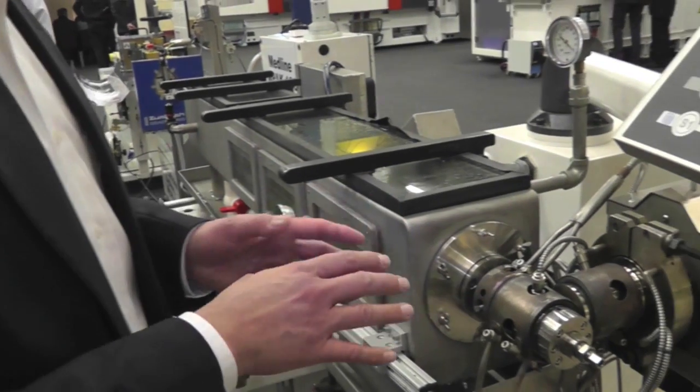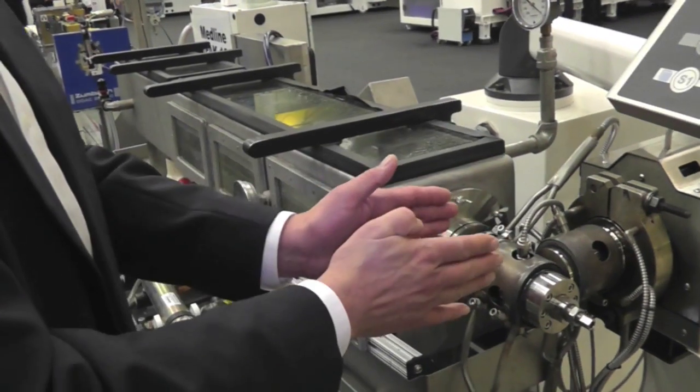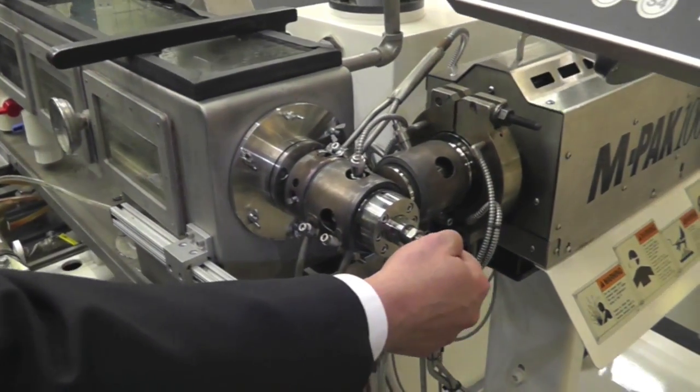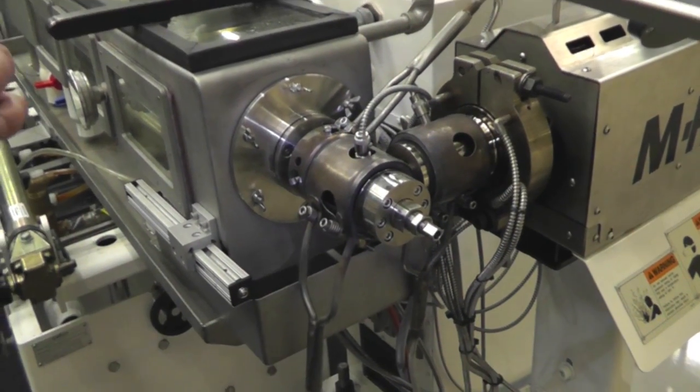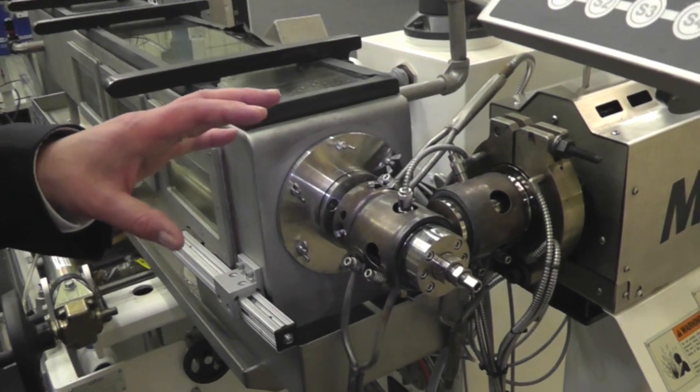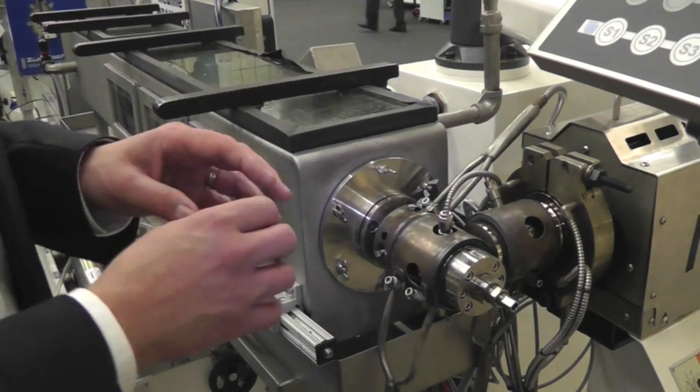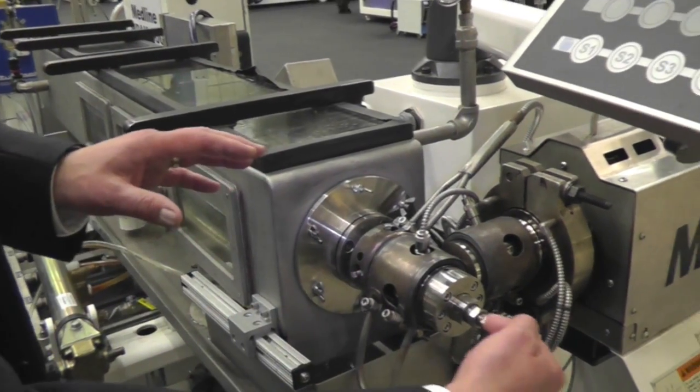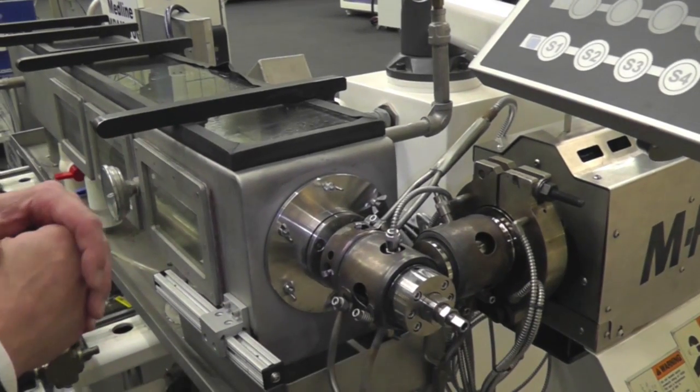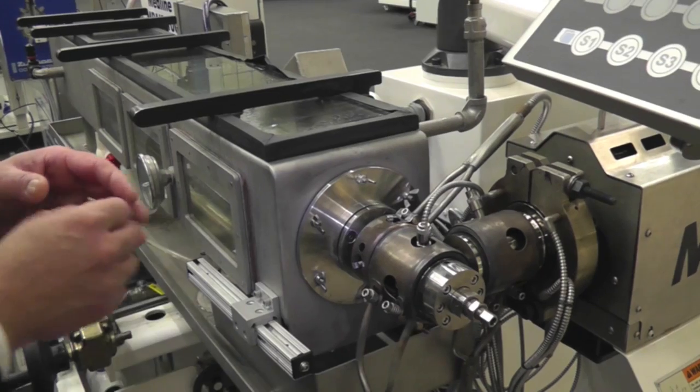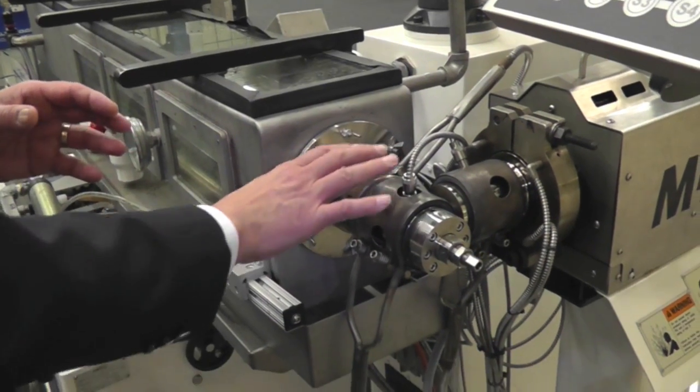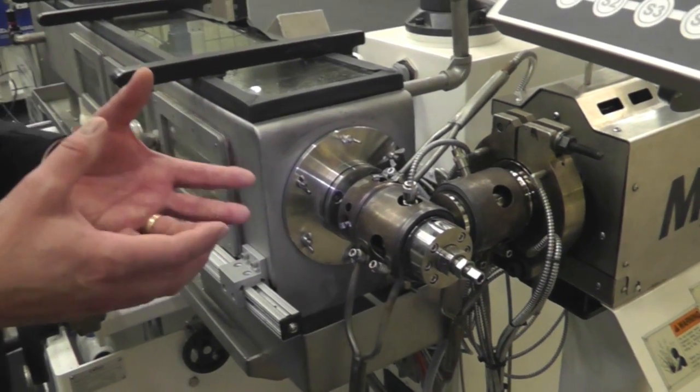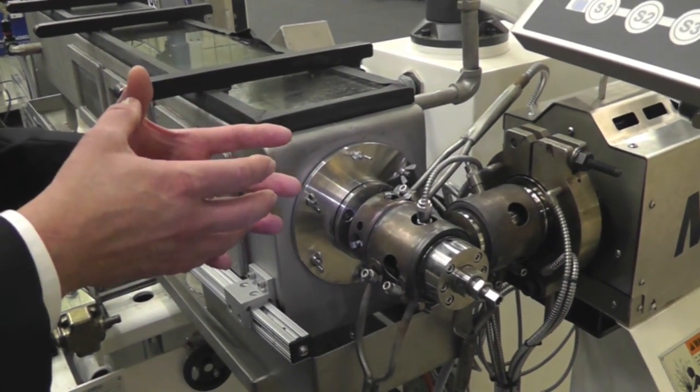This particular die is a cross head, which has the ability to blow air into it if you need to for very small tubes. We could use micro air control for the ID and blow the tube up. It's a very low volume head because we don't want a lot of volume in the tool for degrading the material.